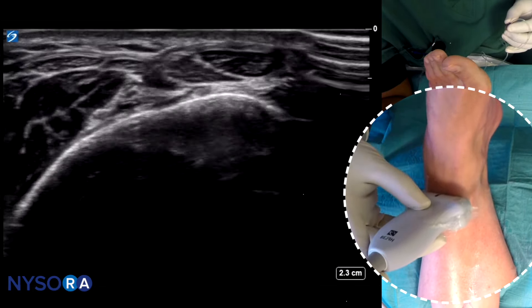Options here include in-plane or out-of-plane; we opted for an out-of-plane approach. Go through the fascia and basically fill that space with the local anesthetic. We have reached that small branch but still need to get to the main trunk a little more anteriorly — without going through the nerve. Now the nerve is surrounded by local anesthetic.